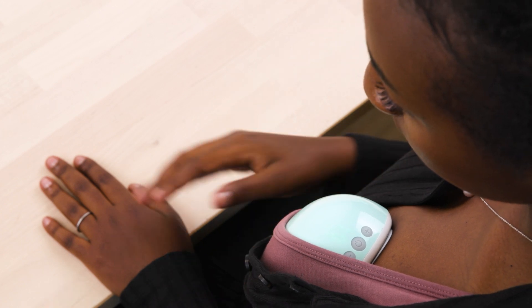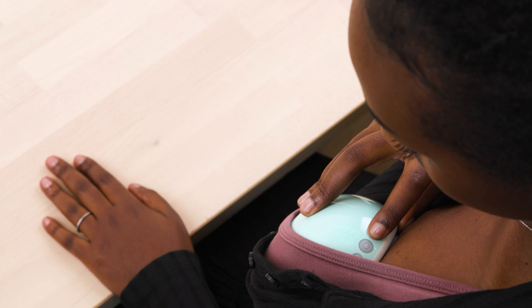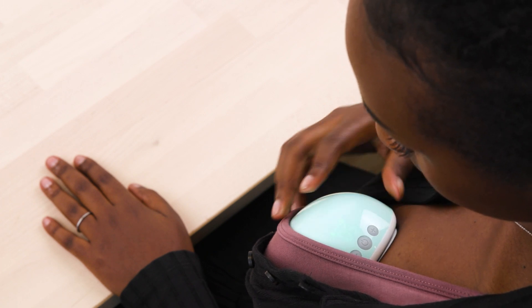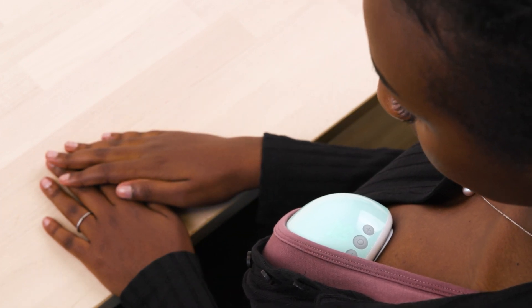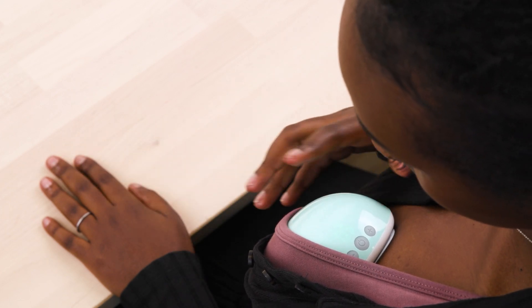When powered on, the display will light up and automatically start at level 1 in the massage mode. The massage mode encourages letdown and the start of milk flow with a suction pattern that has fast cycles and a low suction strength. This mode is activated in levels 1 through 5.